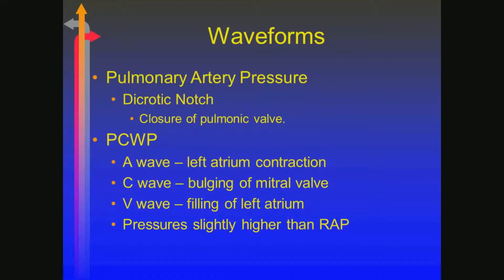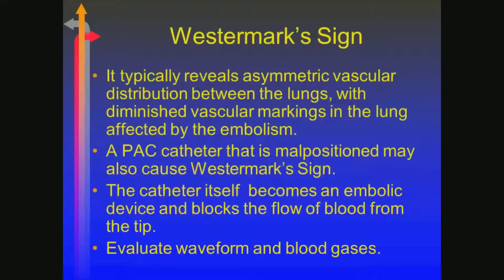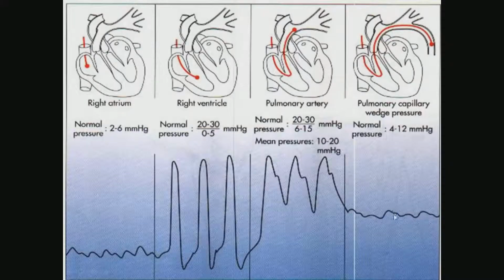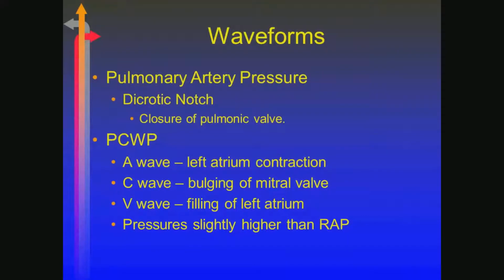Normally we see the pulmonary artery with the dicrotic notch. In theory, and I don't expect you to know this, both the CVP and the wedge tracing have actual changes in waveforms. If we look back here, there's a little bit of a pattern. If we were to mark it out, it has what we call an A, a C, and a V wave. A is the atrium contracting, in this case the left atrium for the wedge pressure, C is the bulging of the mitral valve, and V is the filling of the left atrium.